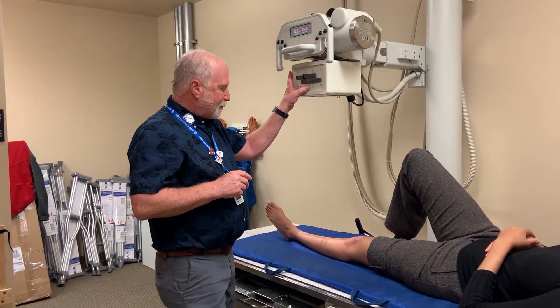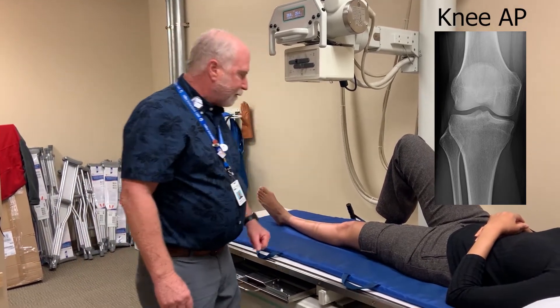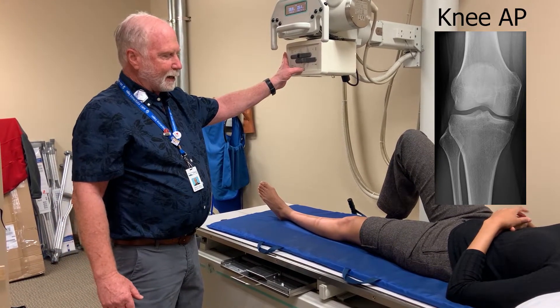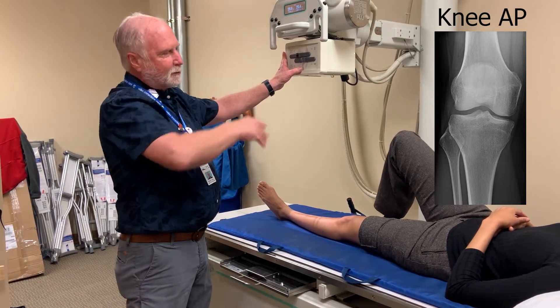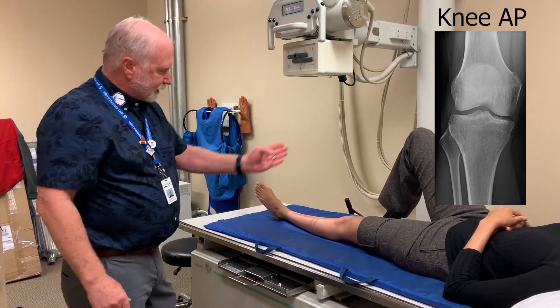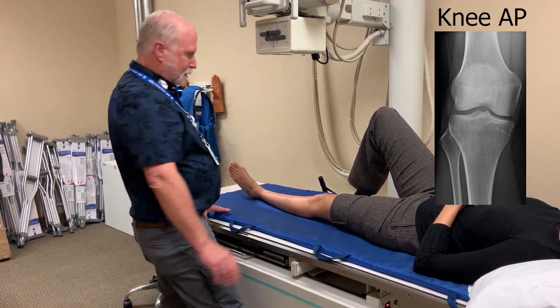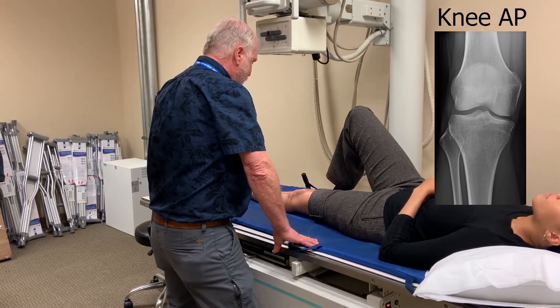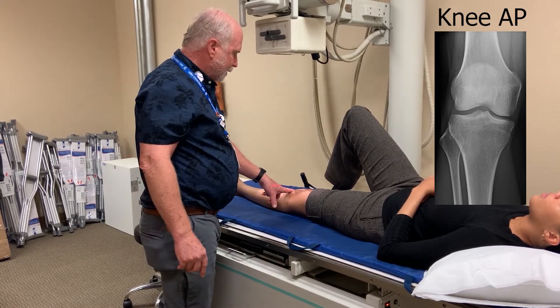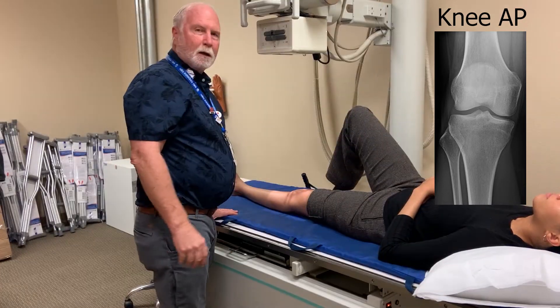Angling on AP is dependent on body habitus. Nikki is pretty straight from her hip down to her ankle, so I'm going to use a straight angle. If somebody had a very large buttocks, I might angle towards the head. Very small buttocks, big calf, I might angle a little bit towards the feet. But Nikki's pretty even, and I'm guessing that joint space is pretty much vertical. I'm going to use the apex or the lower border of the patella as my joint space center. Our joint space ought to be right under that bottom part of the patella. And there's our AP.